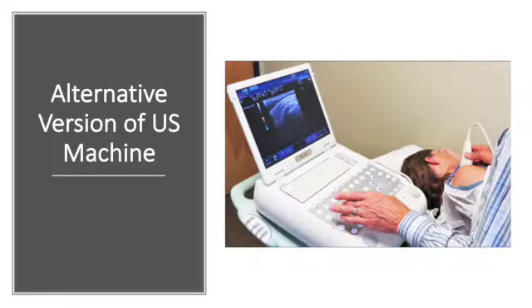This is an alternative version. This is kind of the version from about 10 years ago. So smaller, more portable laptop style version. As you can see, this is a lot easier to port between patients.